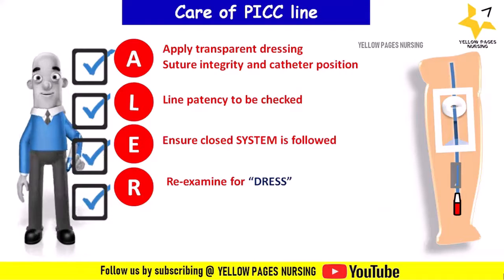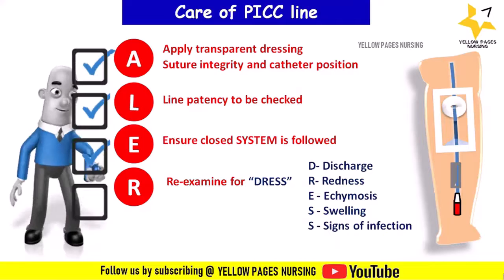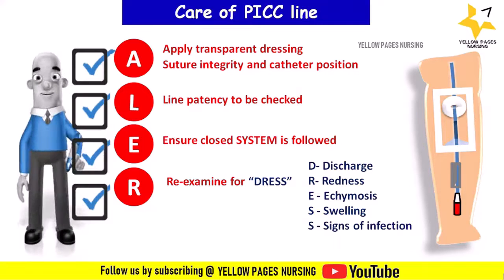Here, the mnemonic DRESS stands for looking for any discharge and redness, ecchymosis, swelling, and signs of systemic or local infection.